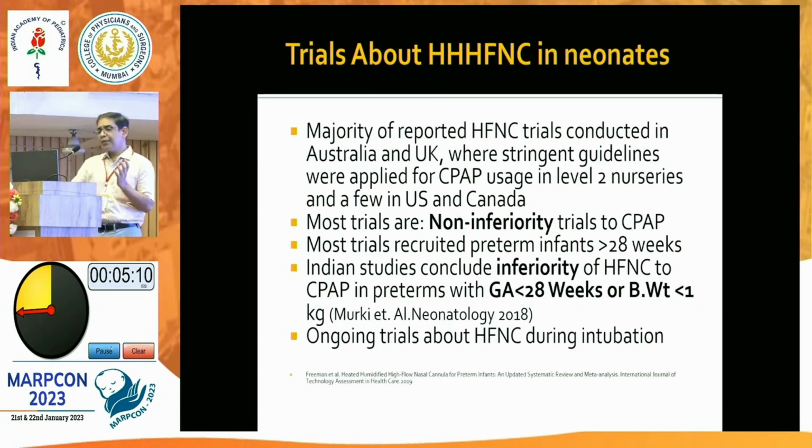Now, what does the evidence show about humidified high flow nasal cannula usage in neonates? Most of the trials show that this modality is useful for babies who are born at gestational age more than 28 weeks or birth weight more than 1 kilo or so.